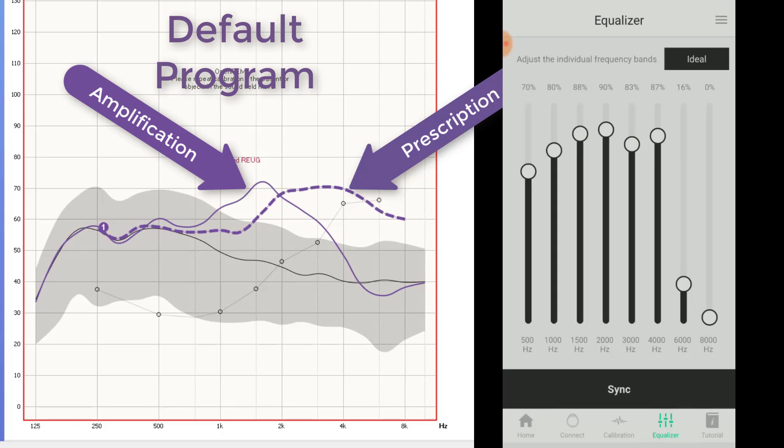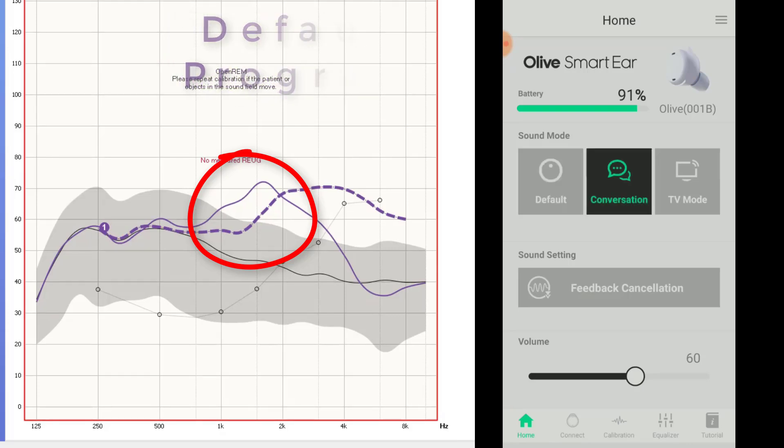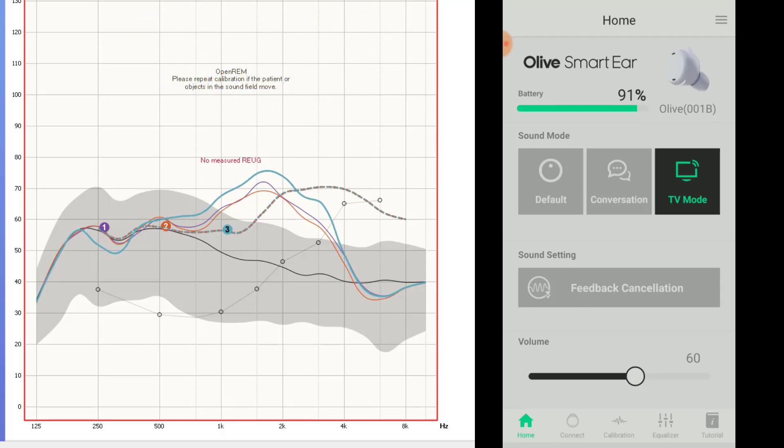We can see that this device primarily amplifies in the mid-frequency range around 1,750 hertz. Switching to the background noise-reducing conversation mode, indicated by the solid red line, it slightly removes some amplification throughout the frequency range. Typically we would expect to see low frequencies reduced for a noise reduction program, which we do not see here. The TV mode, indicated by the solid green line, provides an overall boost to all sound. When evaluating these three settings for someone with a high-frequency hearing loss, we can see that the device does not meet the prescription in the high frequencies for this type of loss.